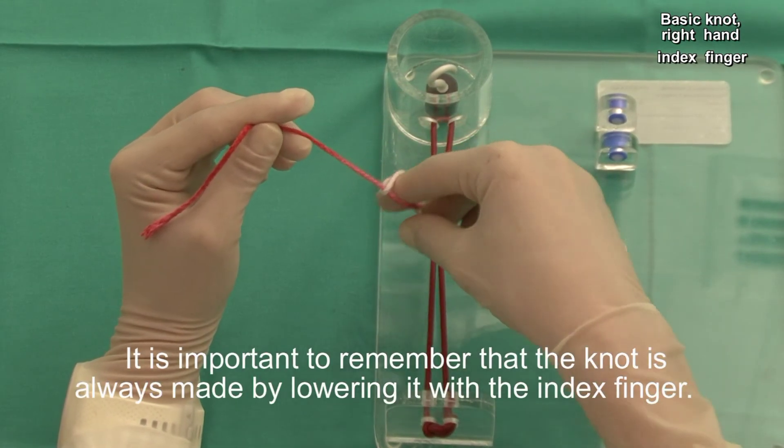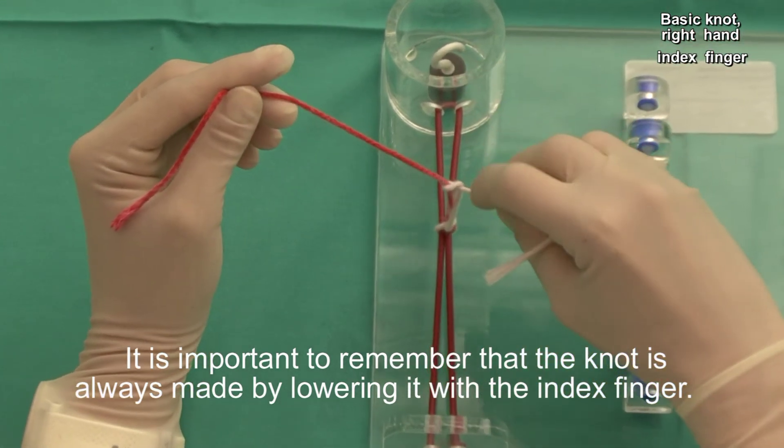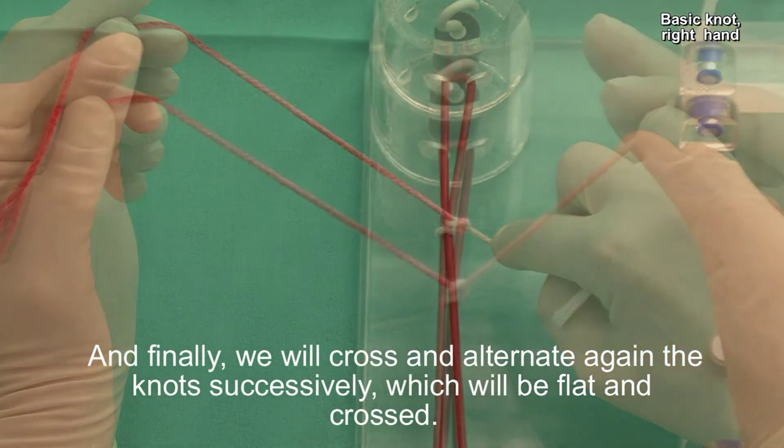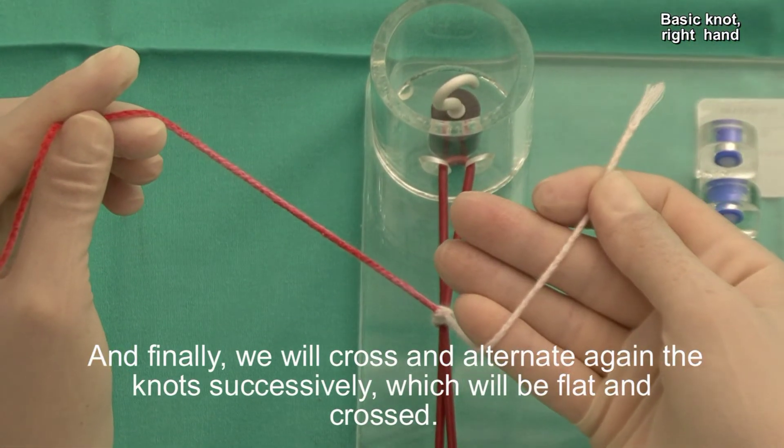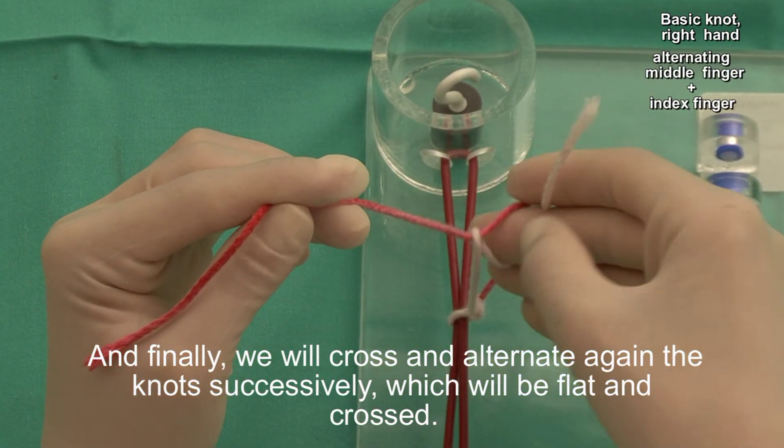It is important to remember that the knot is always made by lowering it with the index finger. And finally, we will cross and alternate again the knots successively, which will be flat and crossed.